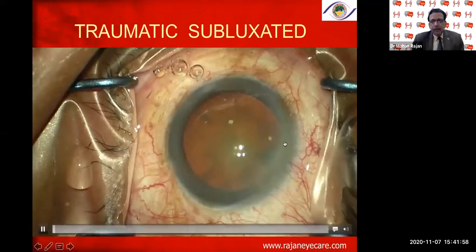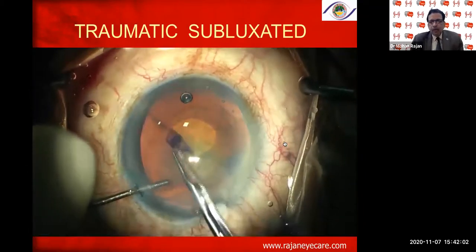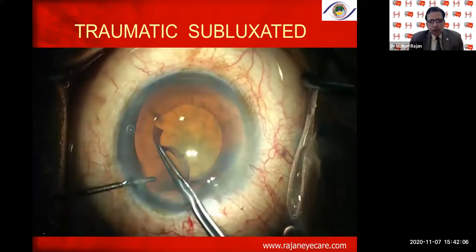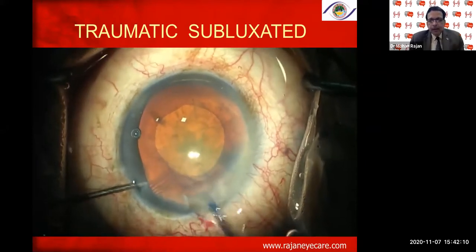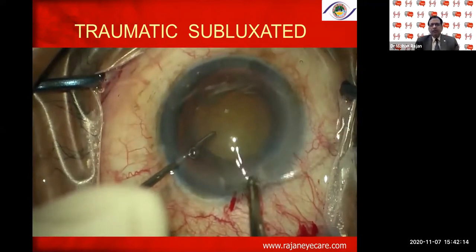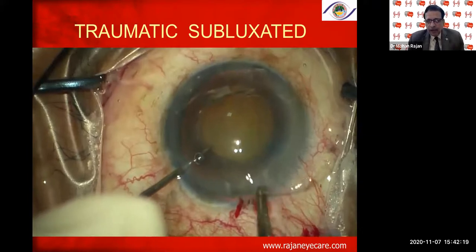This is again a patient that had a traumatic subluxated cataract. You can see here inferiorly there are about 4 or 5 clock hours. I did a fairly good rhexis. This is a patient who had a shuttlecock injury a long time back, and I put a CTR in the beginning itself because I wanted circumferential stability, and then went ahead with the phaco emulsification.